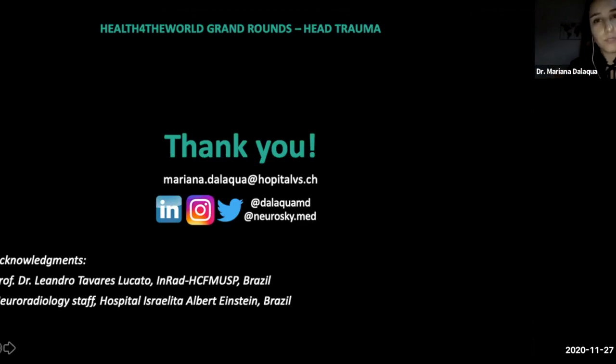Okay. So when should we report the extradural collection volume? I guess volume is not mandatory to report, but as I said, I would report the thickness. I guess this is the most important. And of course, not only the thickness, but what is it causing? Is it causing a midline shift? Is it causing a herniation? Is it causing sulci effacement and all of that?